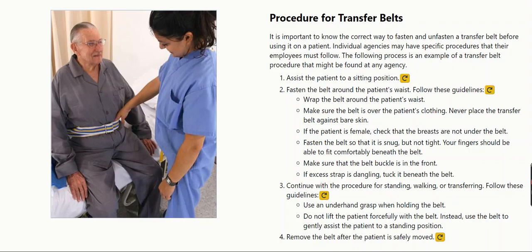Fasten the belt so that it is snug but not tight. Your fingers should be able to fit comfortably beneath the belt. Make sure that the belt buckle is in the front. If excess strap is dangling, tuck it beneath the belt.